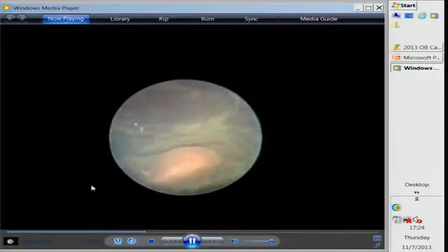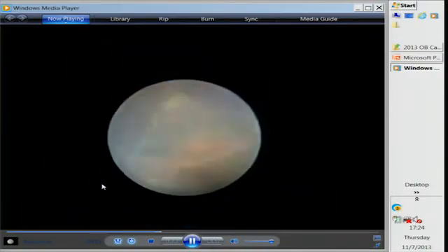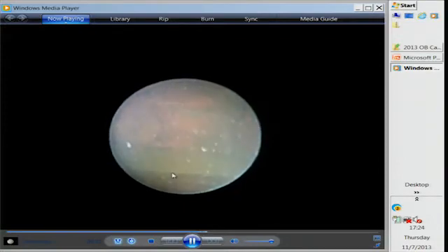Here's the bigger baby, that's baby A. Coming back in. There's the smaller baby. And see, there's the amnion being pushed right against that baby. That baby's kind of pushed way over to the side.